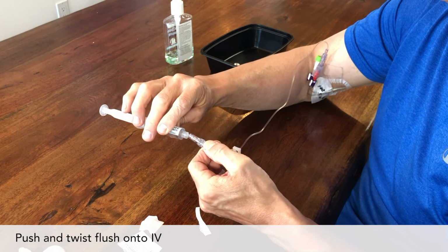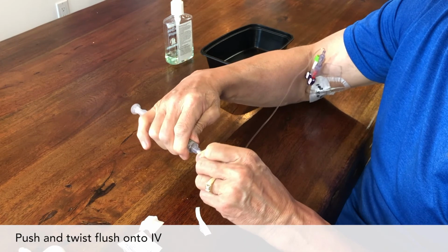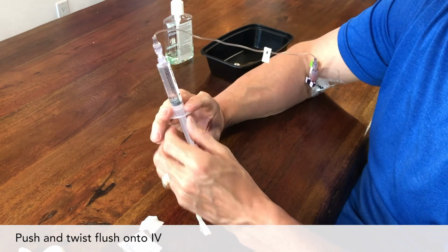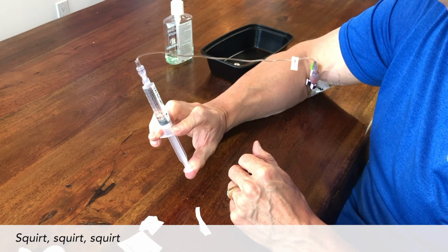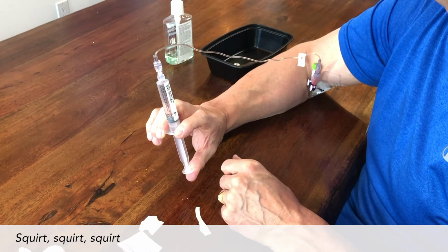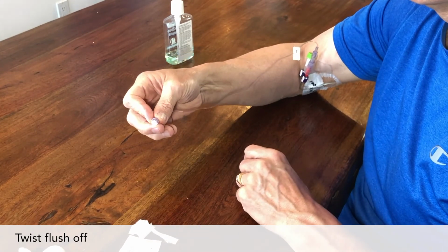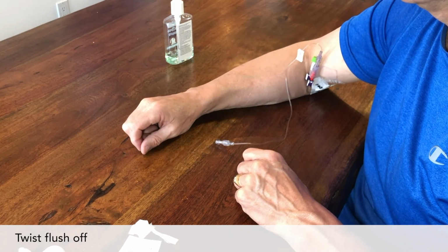Push and twist the flush onto the IV cap. Now push on the tail end of the flush to rinse out your IV. Squirt, squirt, squirt. When the flush is empty, twist the flush off the IV. If you were told to use 2 flushes, scrub the hub again with another swab and flush your IV with another flush.